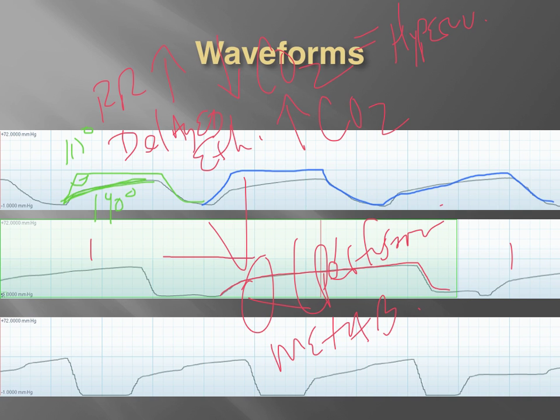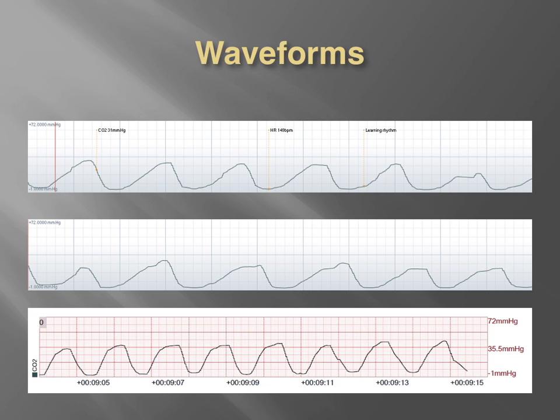Now that I scribbled all over the screen, let's move on. Okay, so here's some much more profound waveforms with bronchoconstriction.